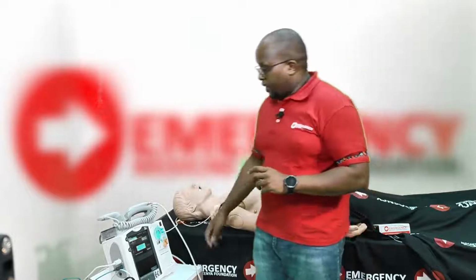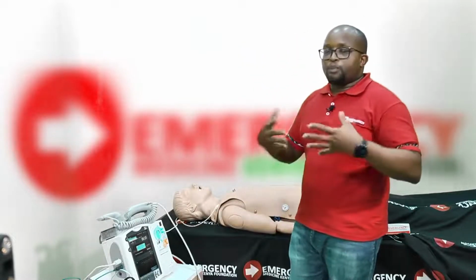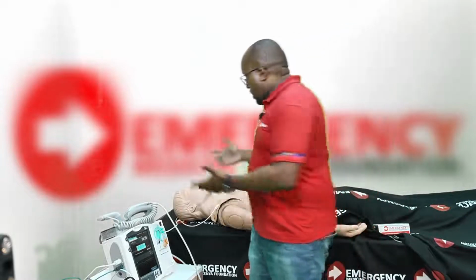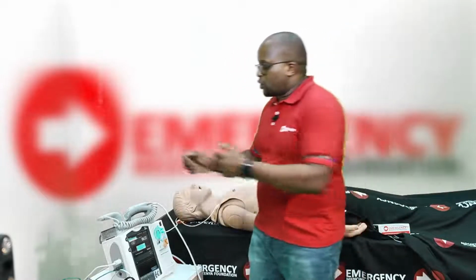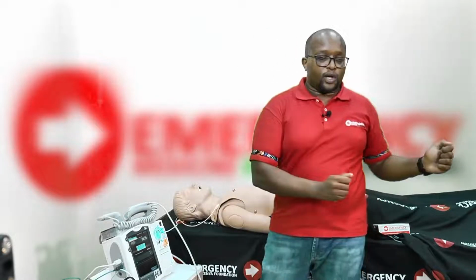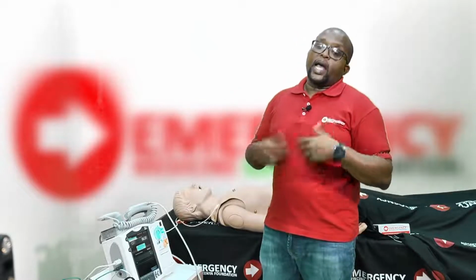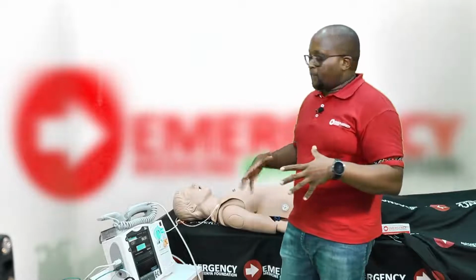All right, so those are the key things to this: making sure that you are what we call pre-charging the defibrillator. What we avoid, though, is that you do not want to move live paddles around. You don't want to move around with paddles that have electricity, because that could easily discharge and shock a patient. All right, so those are the basics of defibrillation.